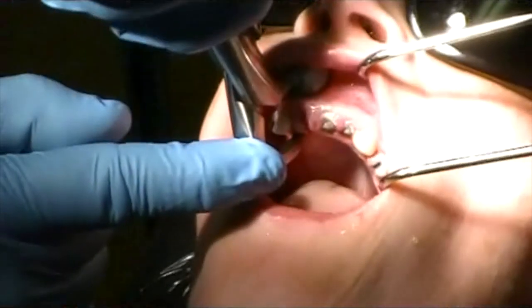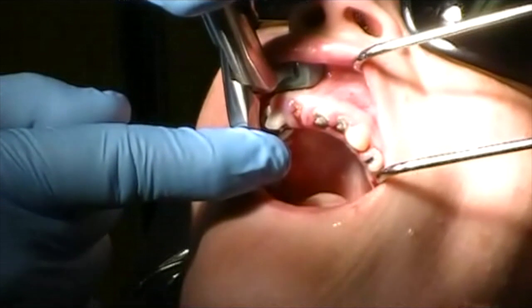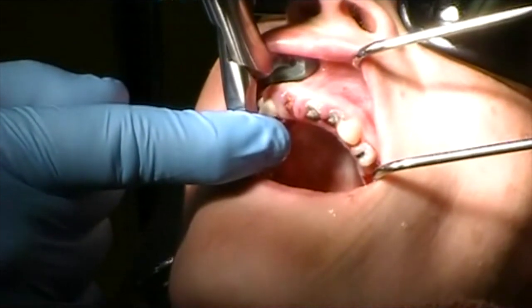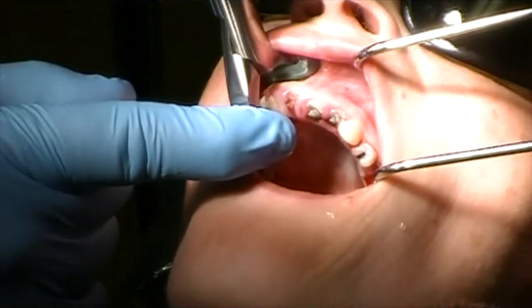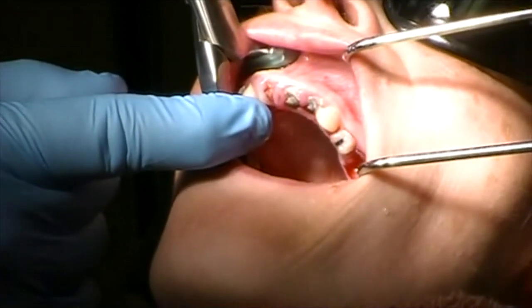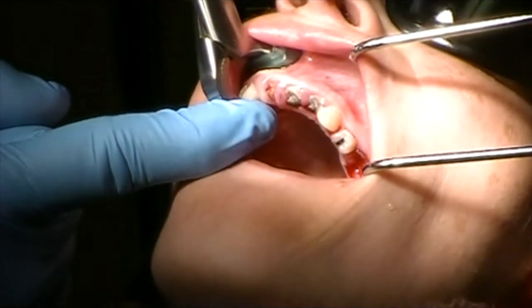You can have a little purchase point with your finger here. What I'm doing is simply rotating my wrist — I am not putting a lot of pressure on the forceps. It's not like a typical forcep. I'm just rotating my wrist towards the patient's eye almost. It may take a full minute, which seems like a long time for us dentists.